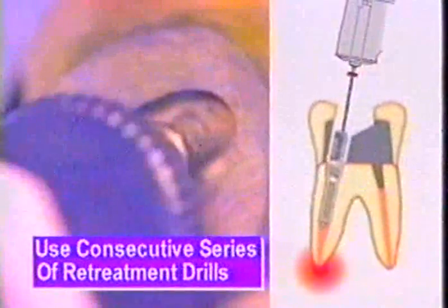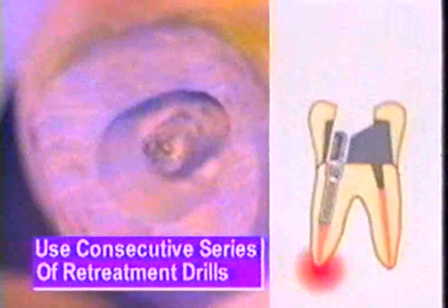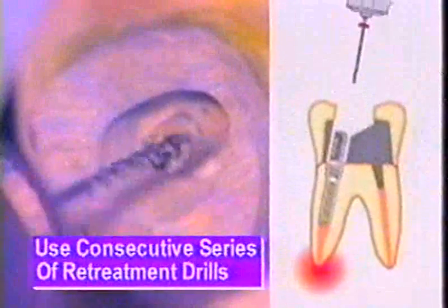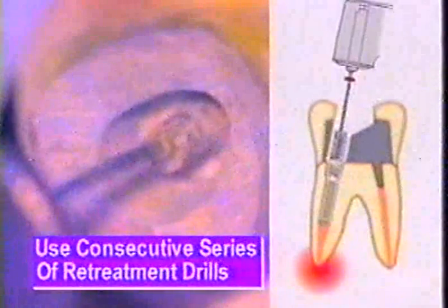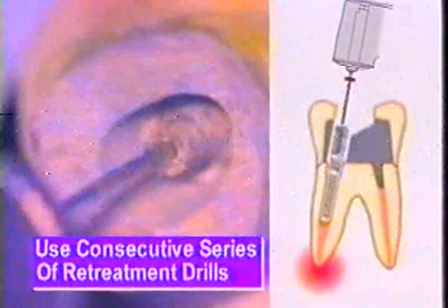To minimize the possibility of the drill catching in the post, drill in small up and down motions, and advance the drill in small increments. The objective of retreatment is to remove the old access post entirely. Note that sometimes during drilling, the second or third drill will bind within the post. If there is enough torque, the cement seal will break and the post will loosen, allowing it to be removed.